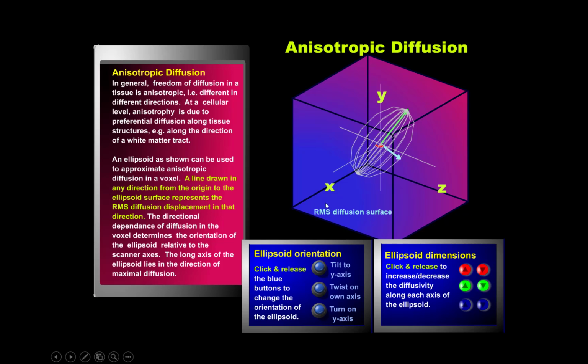Now, in diffusion tensor imaging, the MR collects sufficient data that for every voxel it is able to generate or represent the underlying ellipsoid. Okay? Now, we're not going to go into the detail of the physics and the maths of how it does that, but you can see that it's collecting a lot of information that tells you effectively all you need to know about the degree of diffusion and all you need to know about the direction of the diffusion in every voxel.